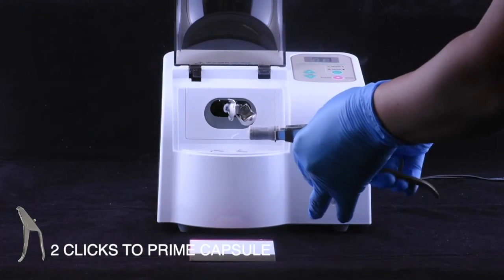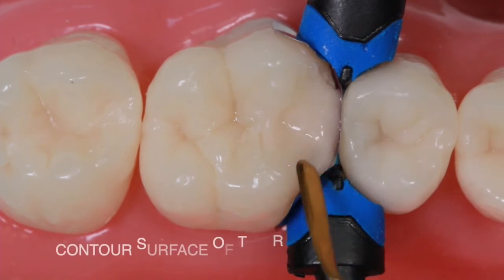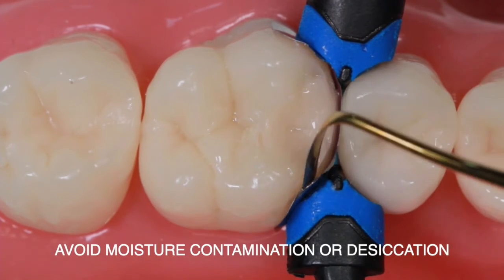Click twice to prime the capsule, then syringe directly into the cavity prepared. Contour the surface of the restoration, making sure to avoid moisture contamination or desiccation.